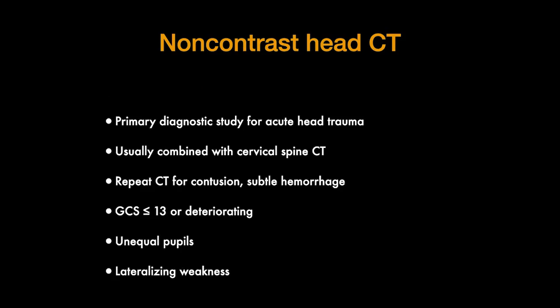Our primary tool is the non-contrast head CT scan. It's the main study for acute head trauma and is usually combined with a cervical spine CT, since injuries to the cervical spine and head often occur at the same time. Repeat head CTs can be obtained 6 to 8 hours after injury to evaluate any changes in contusions or subtle hemorrhage that may be seen on the initial CT scan.